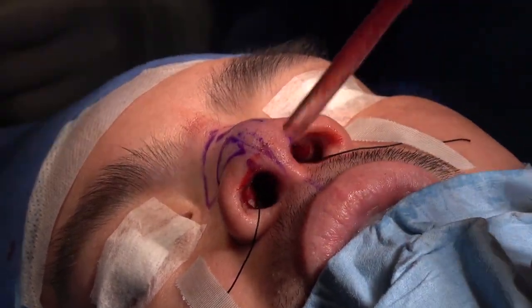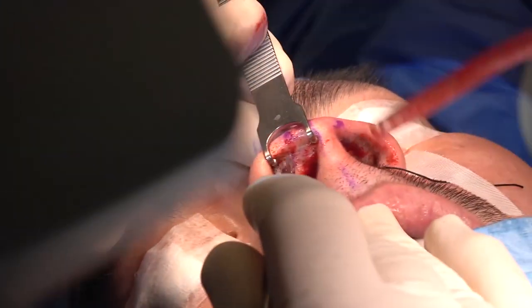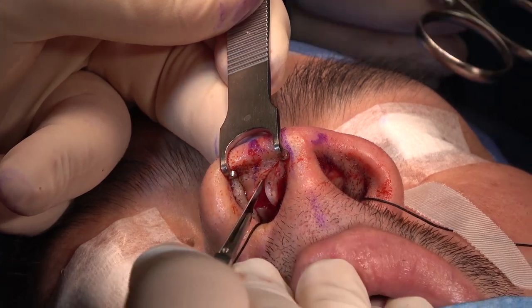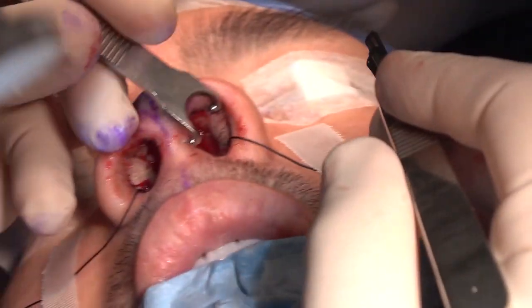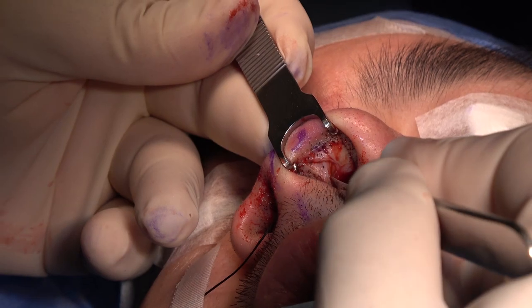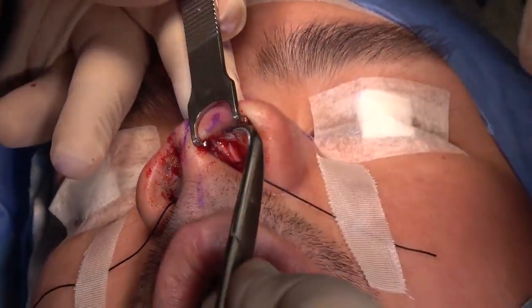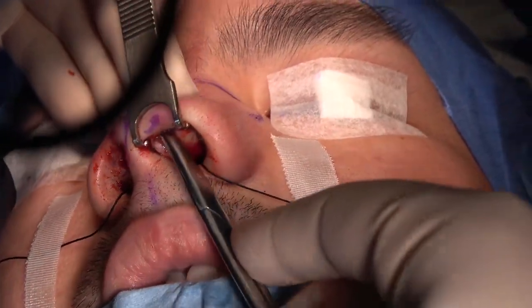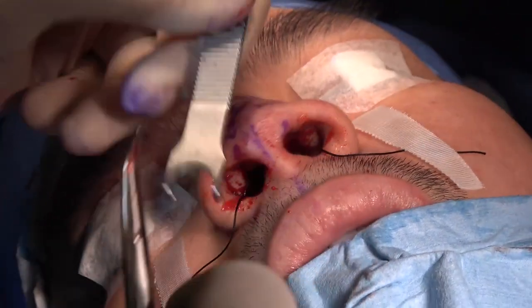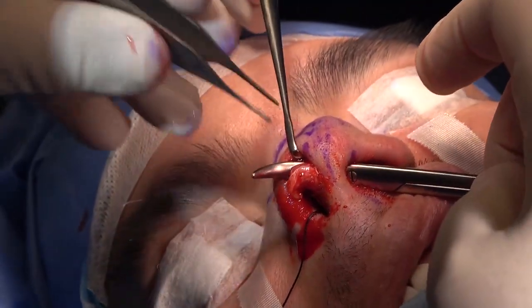Now we start our tip plasty. Holding the medial crura, and this is the junction between the intermediate and lateral crus. We divide the intermediate crus medially, from medial to lateral. So you see we are there in the midline. Again, dividing the intermediate crus from medial to lateral. And look where we are. We are there in the midline. We are leaving the lateral crus alone. We deliver both intermediate crura now to one side, as you see now.